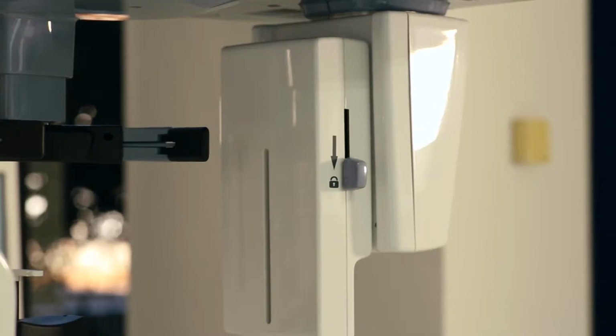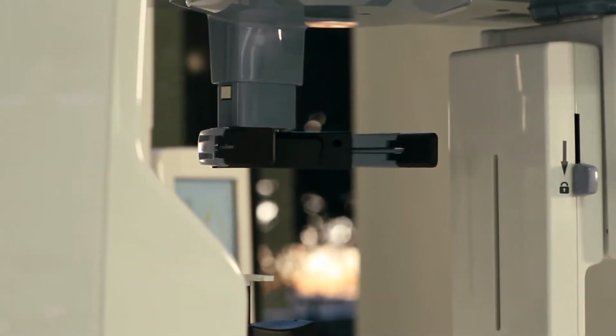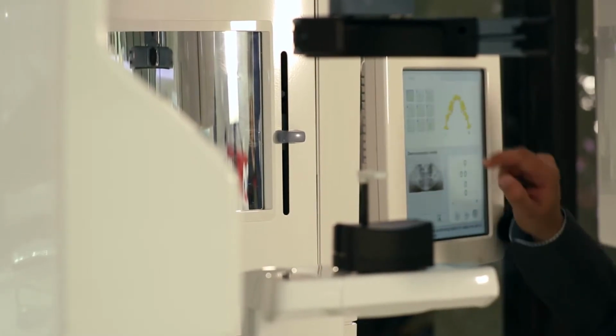We can see the available bone in a prospective implant site and make an accurate measurement. We get a good indication of how many roots a tooth has prior to extraction or endodontic therapy. We can even evaluate the morphology and the anatomy of the root canal system prior to endodontics. Cone beam CT is also great for identifying those early periapical lesions that are otherwise very difficult to identify on conventional 2D imaging. The improvement in diagnosis is absolutely invaluable, and it improves our assessment of dental disease and dental pathology.